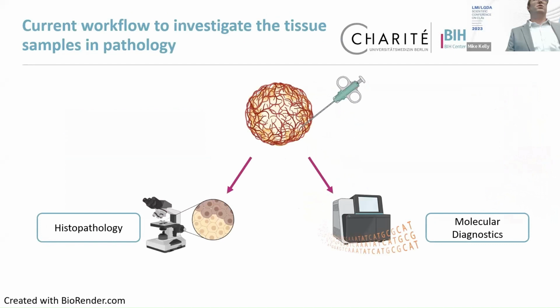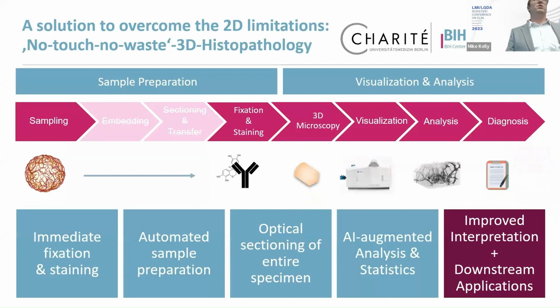So this is then the approach, and we thought, okay, how can we achieve these 3D images? And we said, okay, let's develop a new approach we call 3D histopathology, or no touch, no waste histopathology.